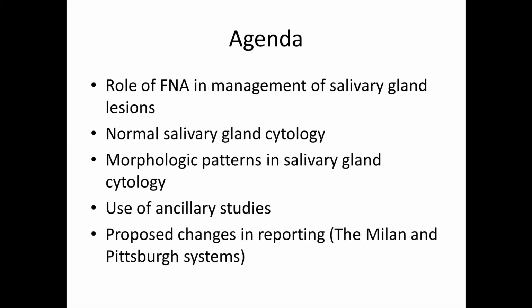And again, we want to approach the topic of salivary gland cytology in a systematic fashion. So first we'll discuss broadly the role of FNA in the management of salivary gland lesions and just touch upon the role of pathology in the management of salivary gland lesions in general. Next we'll discuss the normal morphologic findings in a salivary gland aspirate. After that we'll spend the bulk of the talk discussing the various morphologic patterns that you can see in salivary gland cytology. So what are the big broad categories of patterns that you can see, and how do you use those patterns and other more discrete features to hone down on a definitive diagnosis if possible in these cases.